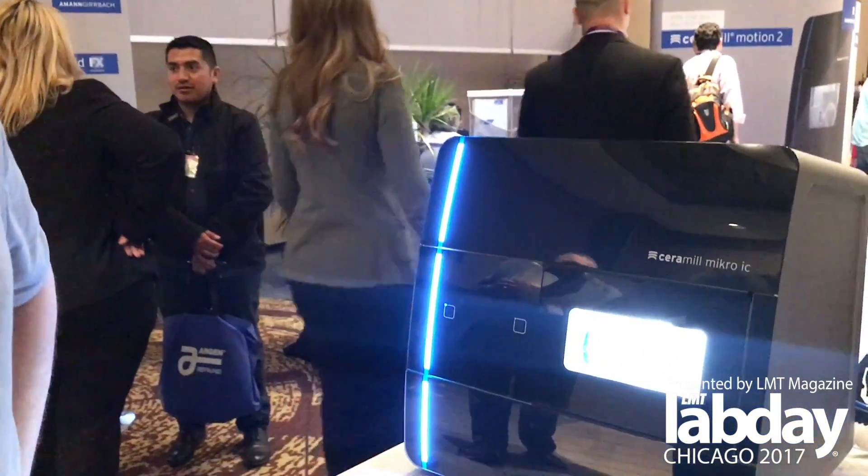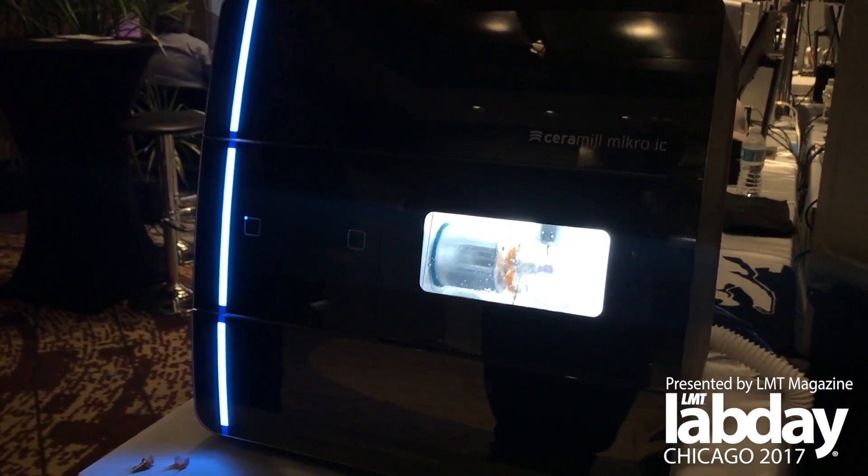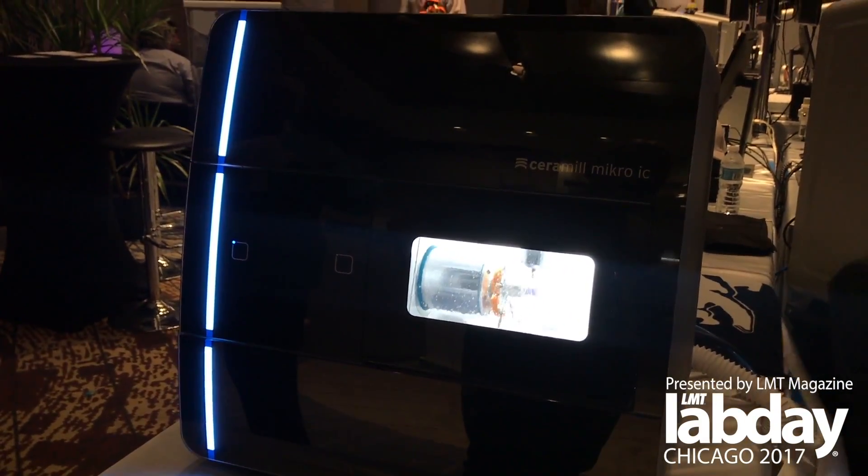We have two options: HD milling and regular milling. We are averaging 15 minutes for a non-HD unit and about 22 minutes for an HD molar.